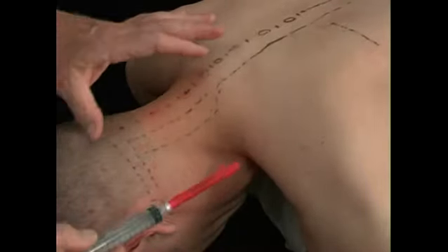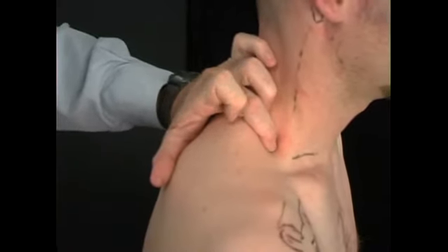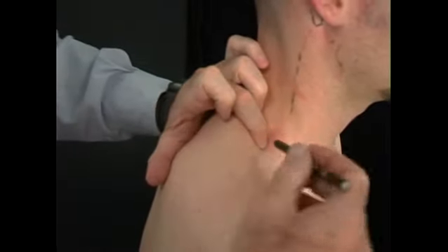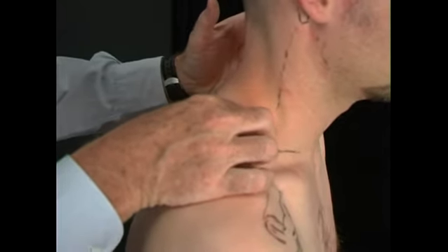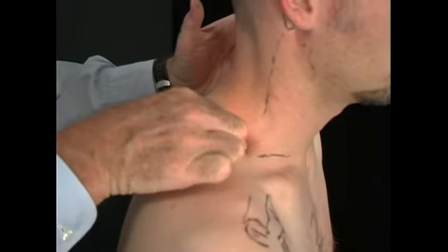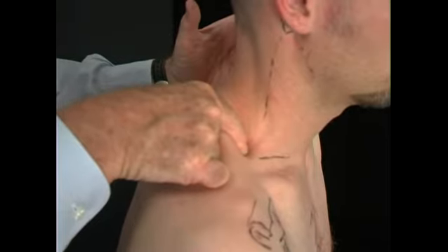These injections can also be done in the sitting position. We talked earlier about doing the injections of the C7 transverse process and the first and second ribs in the sitting position. So if we push the trapezius back and aside, and we come in and find the bump of the C7 transverse process, it's right there. One has to push in quite firmly in many people to hit it, but that's it right there.